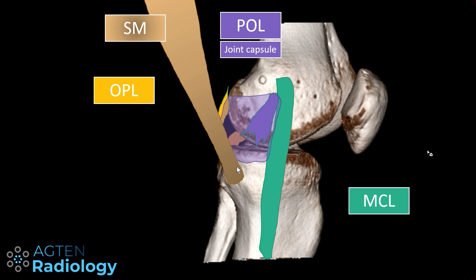This is the semimembranosus muscle, which is part of the posterior medial corner and a very important dynamic stabilizer. Then here, only partially seen, is the oblique popliteal ligament, which I will show you in a minute.